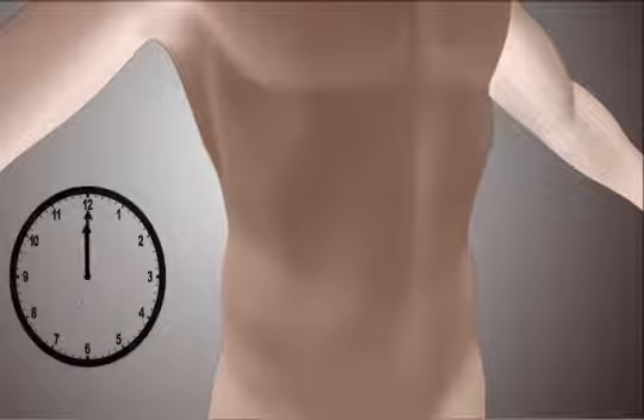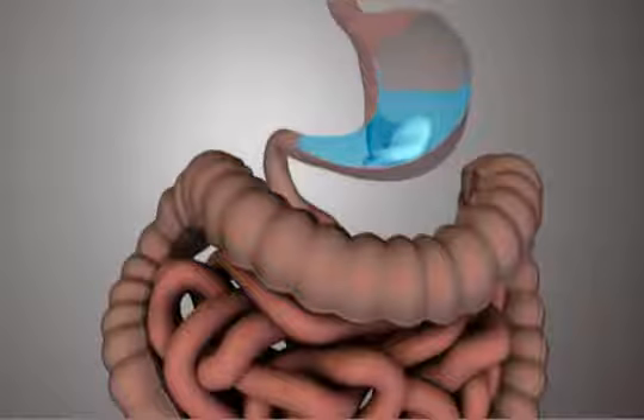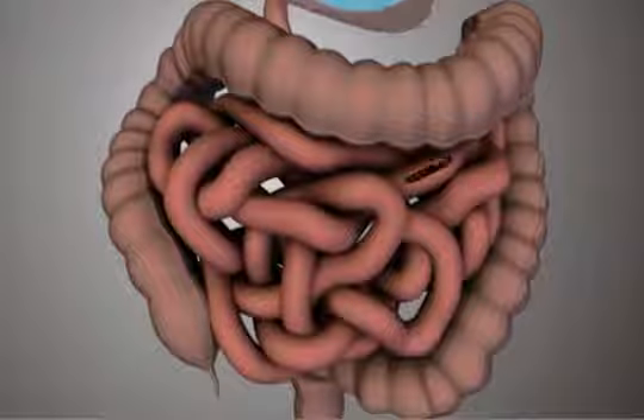The Ellipse contains a release valve that opens by itself at the end of therapy, allowing the device to empty. The empty device is small and flexible, allowing it to transit the gastrointestinal tract until it is excreted.